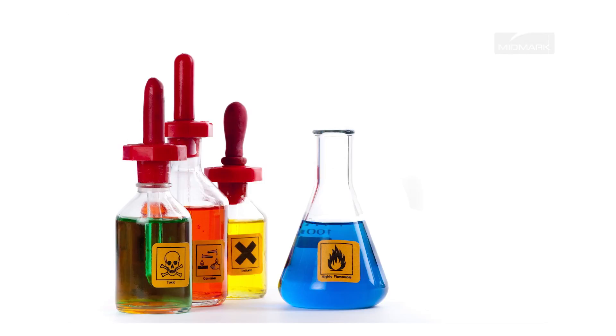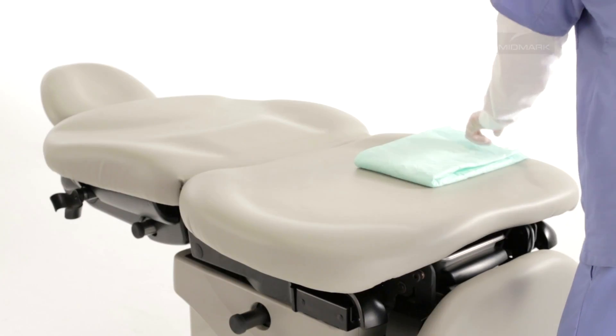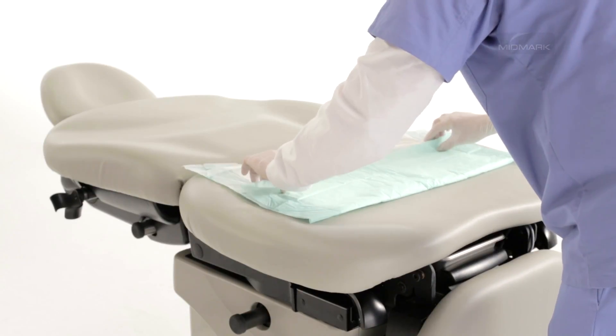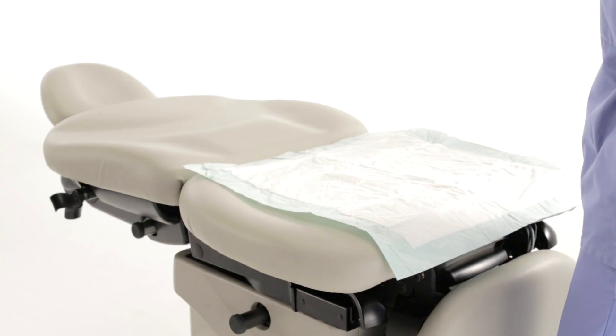Please refer to the 630 User Guide for a list of active ingredients that are considered QUAT-type chemistries. Always make sure the upholstery surface is completely dry before applying table paper. Please note that certain substances used during procedures, like iodine-based antiseptics, may cause permanent staining. Make sure to protect all surfaces from these types of substances. Please refer to the 630 User Guide for complete guidelines.